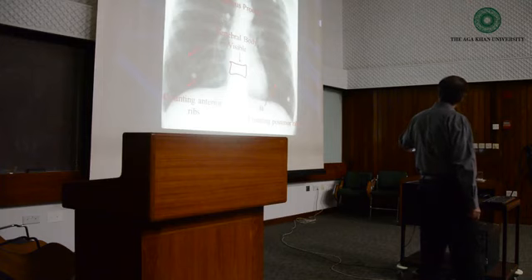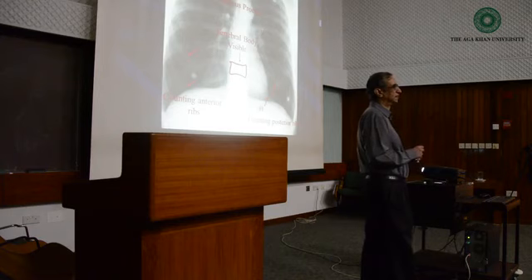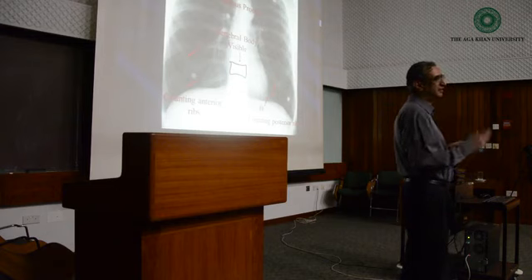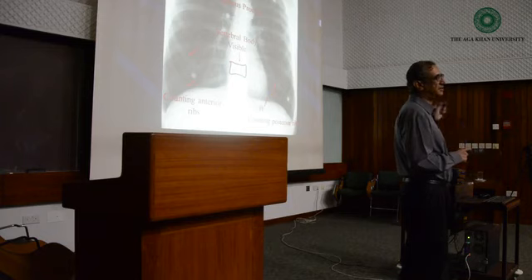Yes. So which disease is very common in the upper lungs? Any idea? In the apex, do you know TB likes to be in the apex? And there is a reason for it. Why?